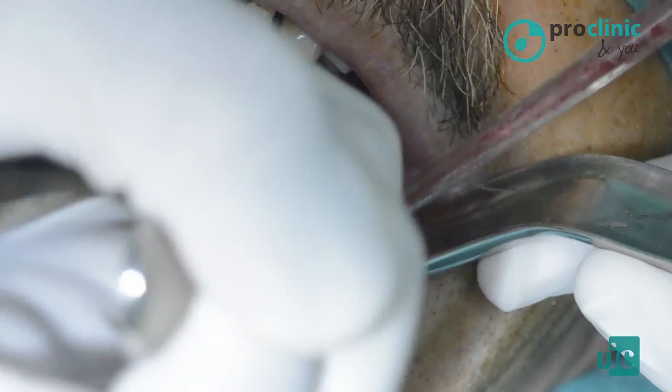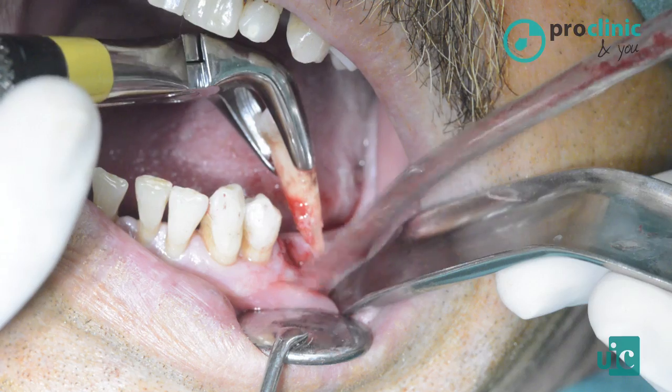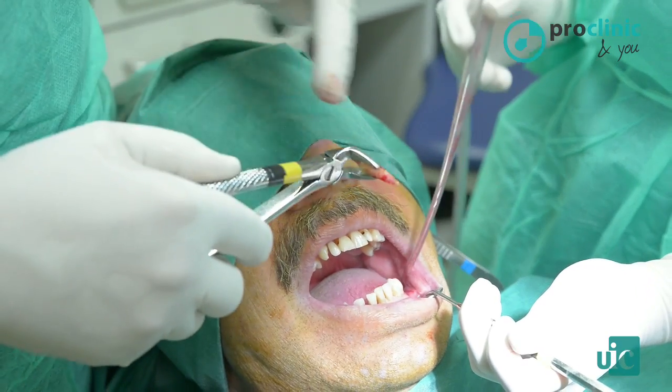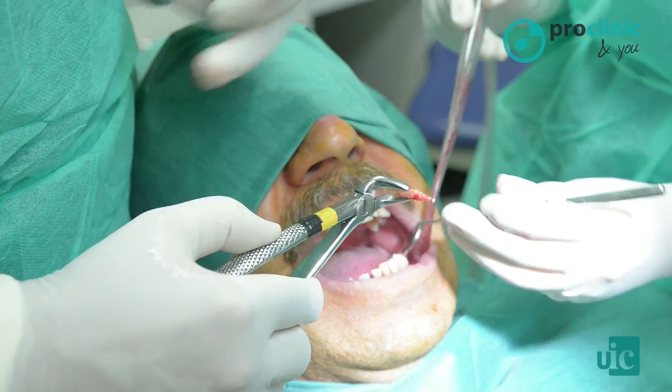Little by little, the tooth comes out of the alveolus. If you pay attention, you can see how the forceps catch almost 50% of the root surface.